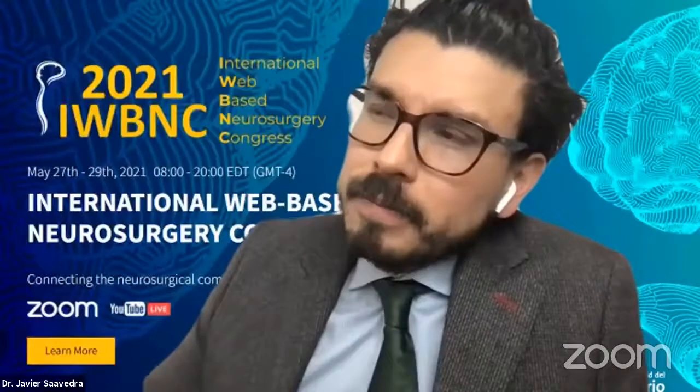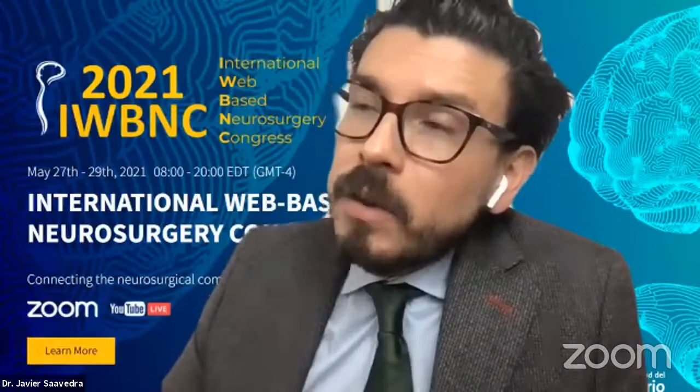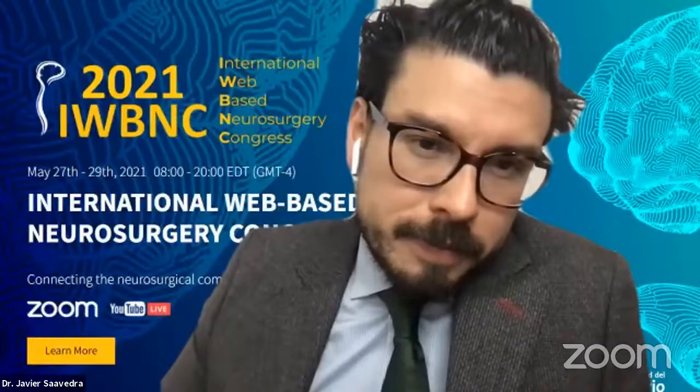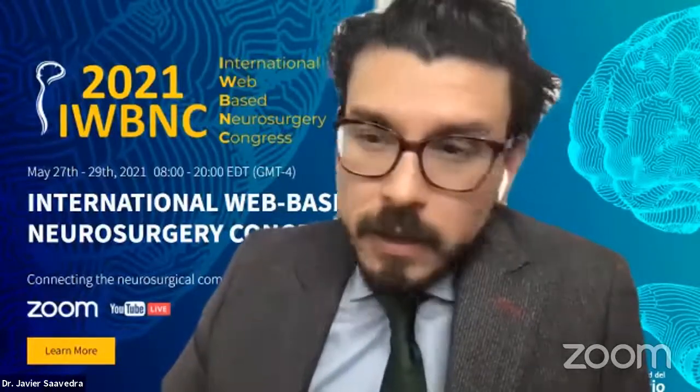Perfect, thank you. Joaquin Seigel is asking, did you use the transconjunctival approach like precaruncular for lesions medial to the optic nerve? No, I haven't, because that can be done, but it seems that doing it transnasally is easier, and there's more experience doing it. So I use a transnasal approach.